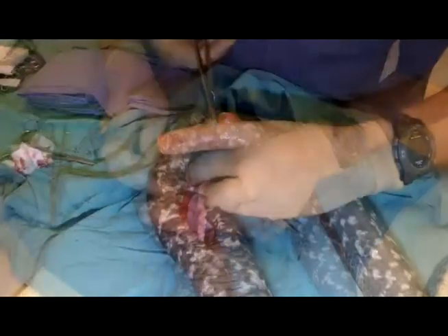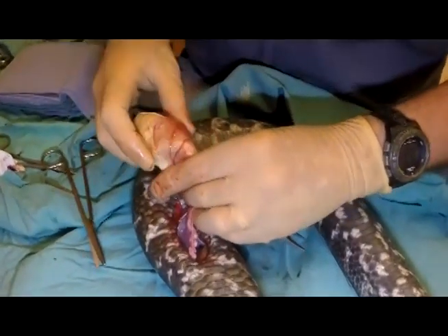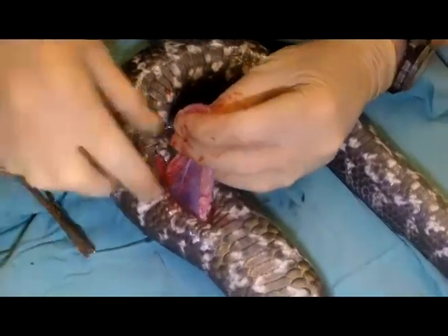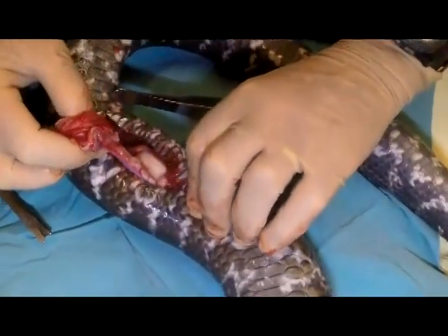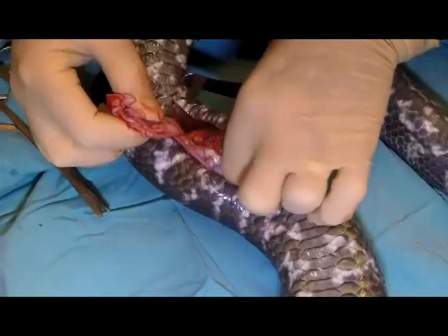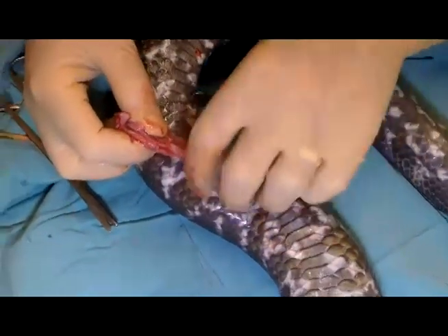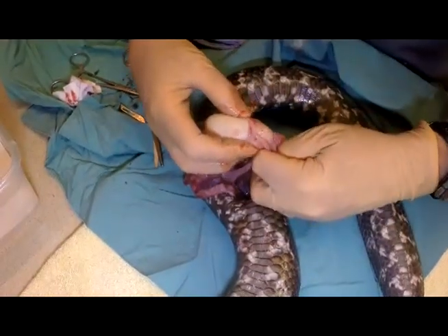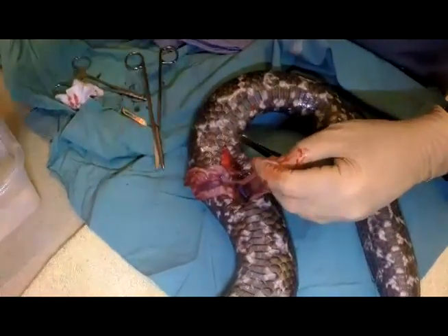You can see here that the removal of the shell membrane then allows the egg to pop out, and this would then go off to the incubator. This was repeated numerous times by bringing the eggs and applying pressure from further up the body to essentially milk them down so that we could then remove the cranial eggs, or the eggs that were located towards the front of the body, out through this incision.